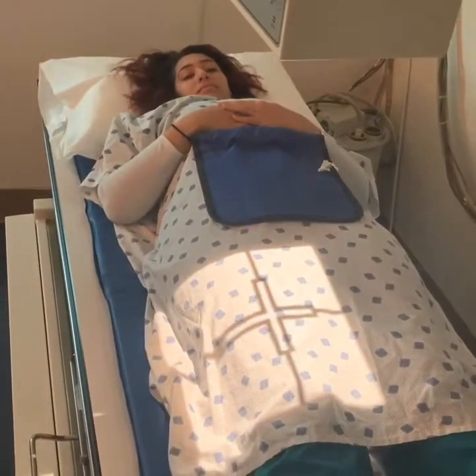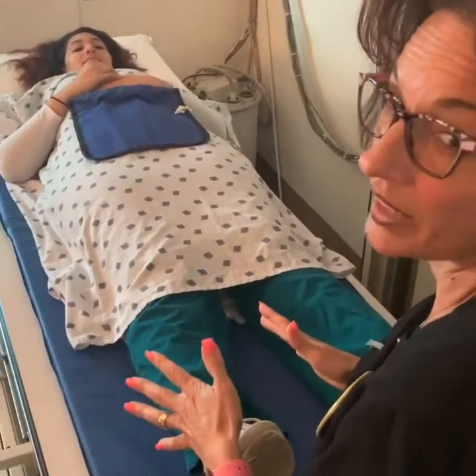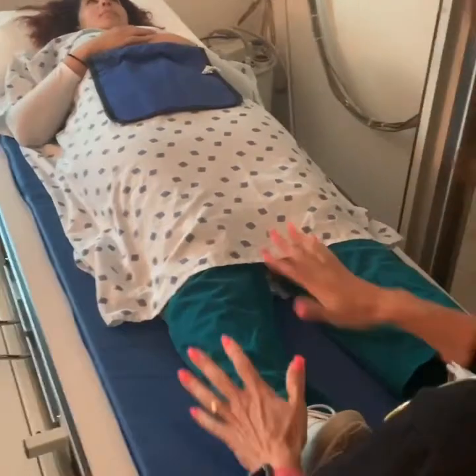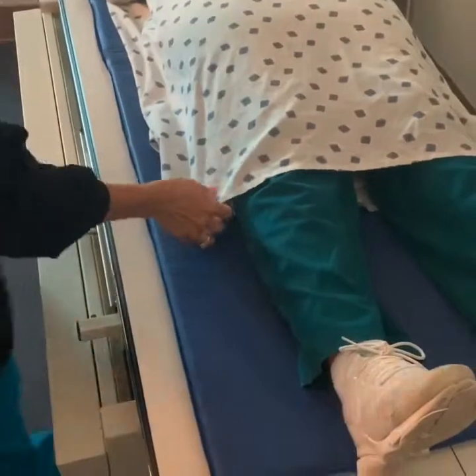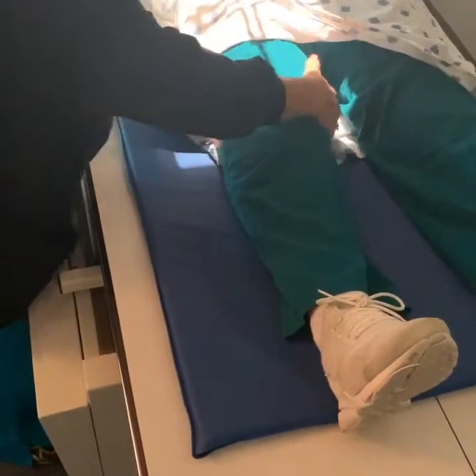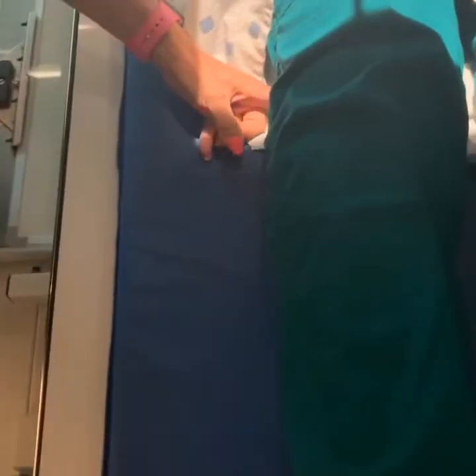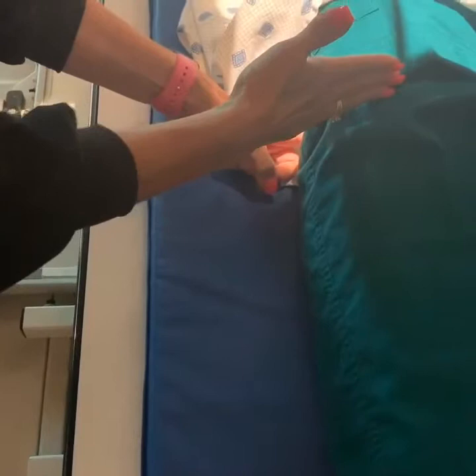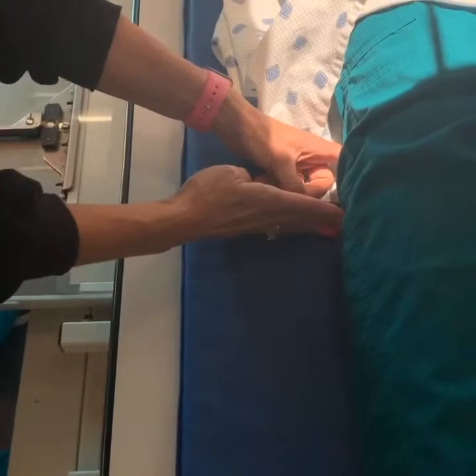So what we're gonna do on this one is just get your, can you pause that? Okay, so on AP distal femur, what we're gonna do is normally the patient, you would likely be able to see their leg, but we know we need to include the knee joint. So bend your knee for me. I'm just doing this to show you guys. Her knee is right here, straighten it out. So what we wanna do is make sure that the IR goes beyond there, which remember the light is kind of deceiving. So the IR actually goes to about here, which is good because that's about 2 inches below the knee.